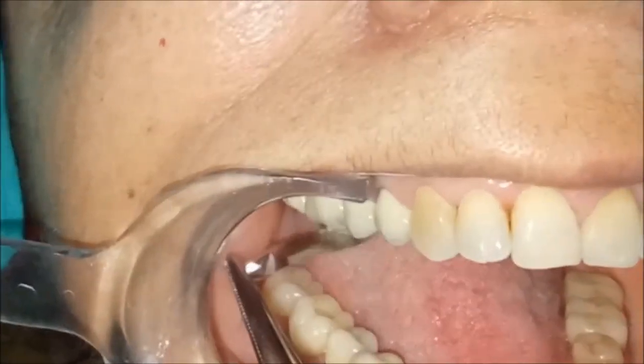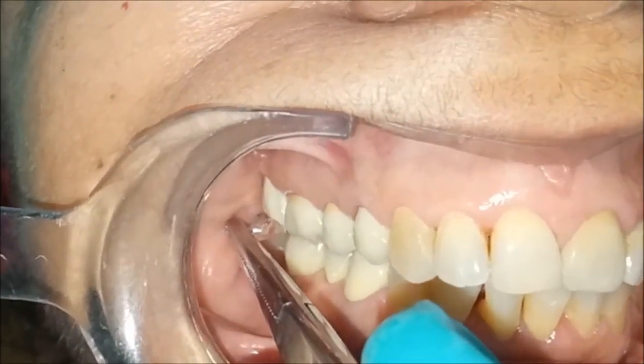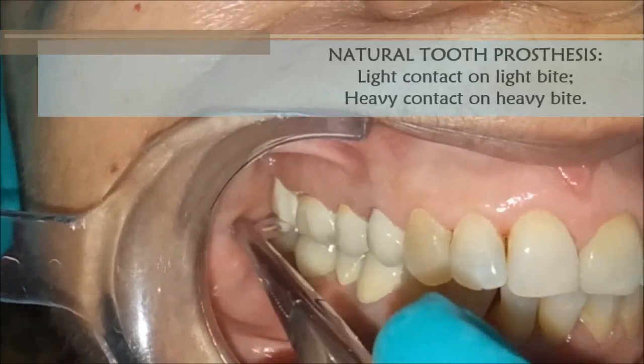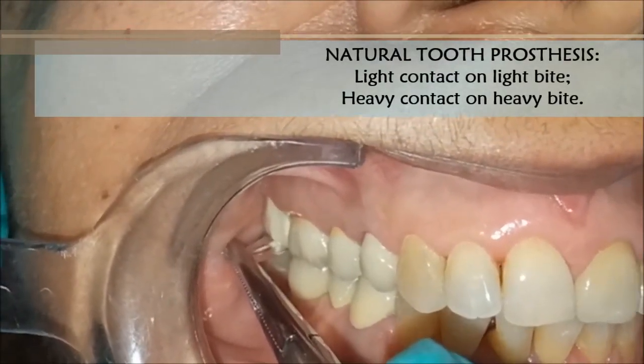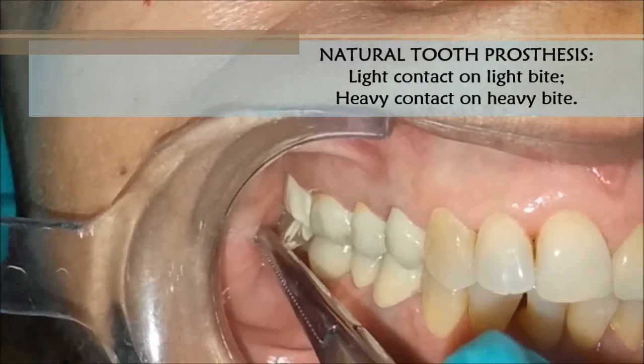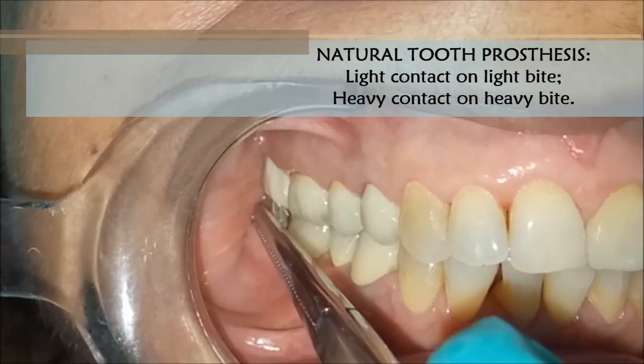Now when I keep this on the adjacent molar, just bite down. This should give me an immediate tuck back. She is not even clenching down but that 4.7 is giving me a definite resistance to pull. This tells me my 4.7 has a good positive contact whilst my 4.6 occlusion is correct as well.